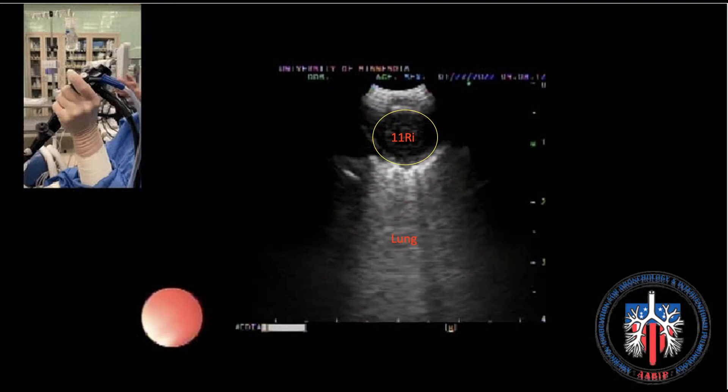There are no specific ultrasound landmarks; however, 11R inferior is visualized in close proximity to branches of the interlobar pulmonary artery, as shown here. The control lever should be slightly flexed, and starting at the 12 to 1 o'clock position, the hand position rotated counterclockwise until the lymph nodes come into view.